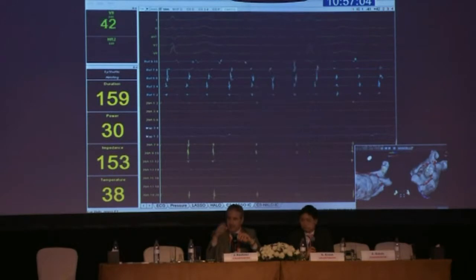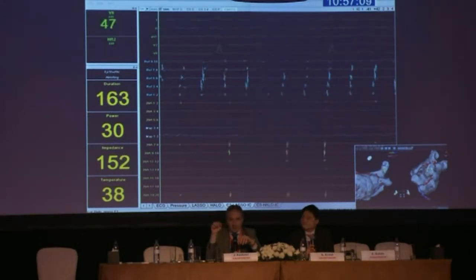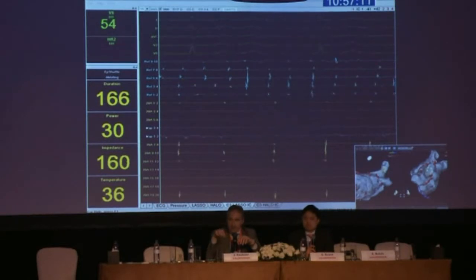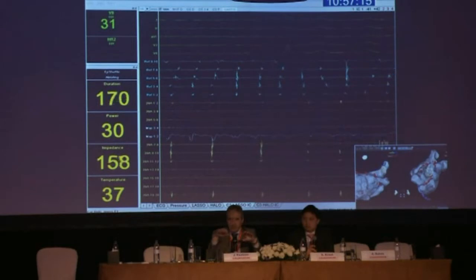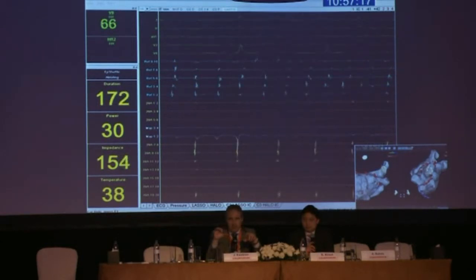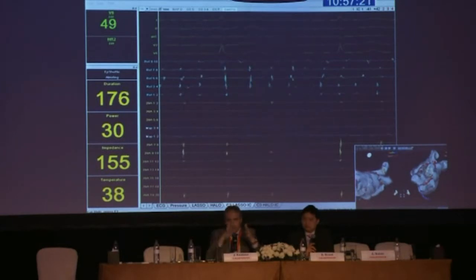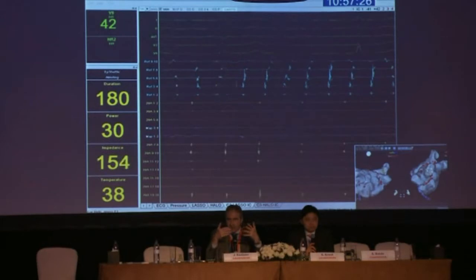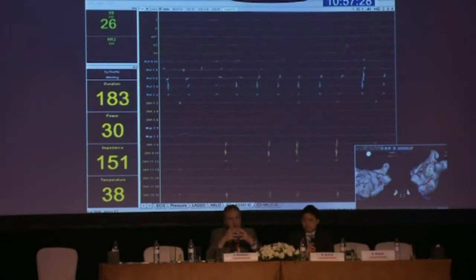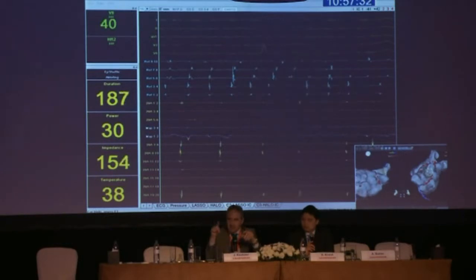But still, I believe now, with the data we have from clinical experience, we always do a circumferential line, despite the fact that you have isolation after, let's say, ablating only a quarter of the vein. Because if you leave visual gaps, they can reconduct, or conduction can occur because you have some muscle there. So I think it's a much better strategy to do this kind of circumferential ablation.